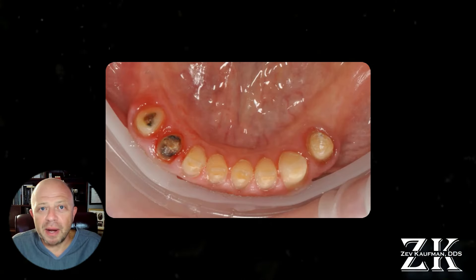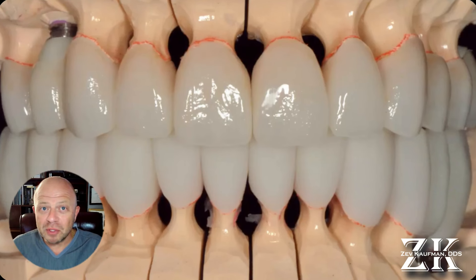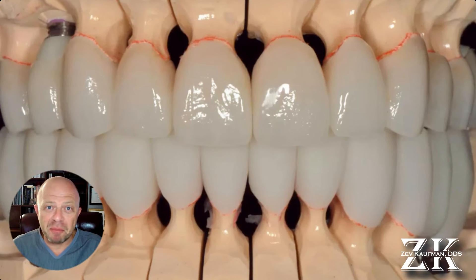You can actually see that she ground herself down. It's called a collapsed vertical dimension of occlusion. As we lose the vertical dimension of occlusion, we end up looking older as our mouth collapses. I took a protrusive photo — meaning bringing your lower jaw forward — and you can actually see the damage that happened over the years, as well as the not-so-great dentistry she had. Here's the occlusal view: you can see what happened to the upper and lower teeth, and she's actually missing teeth on both the lower left and lower right side.